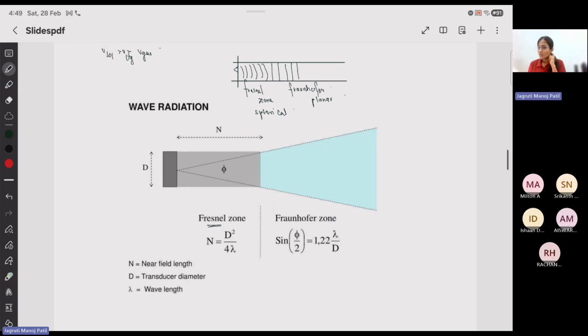In terms of losses, whenever these waves start to emanate from the sensing element, they have simultaneous constructive and destructive interferences. When these interferences reach an order where you no longer have destructive interference, you always have planar fields, and you don't have any losses due to diffraction.